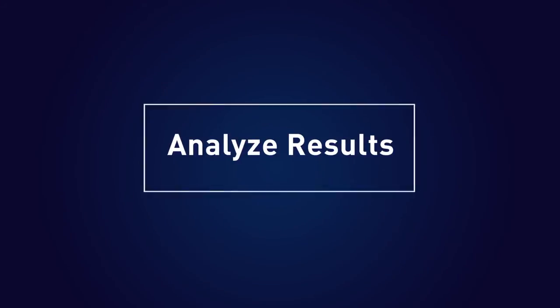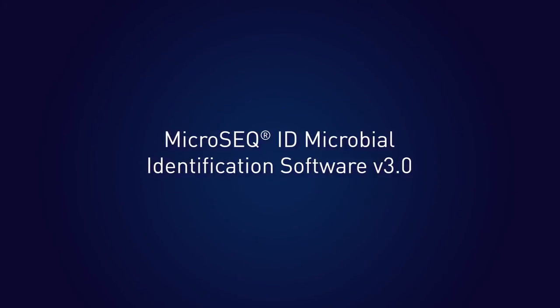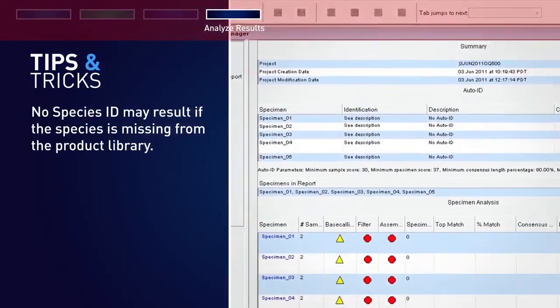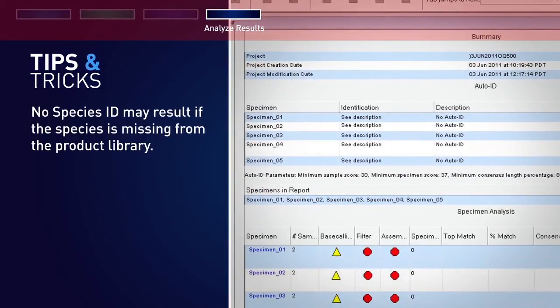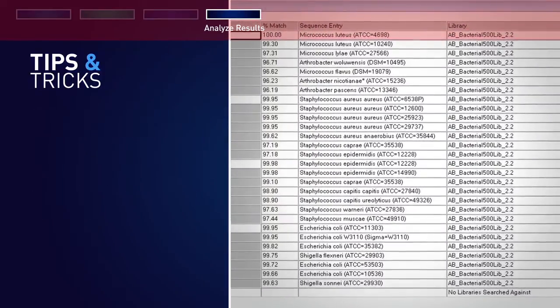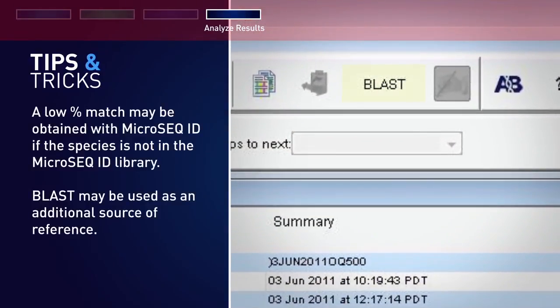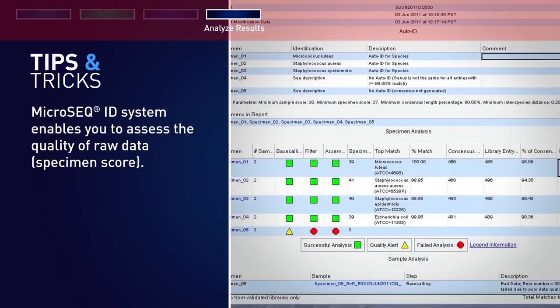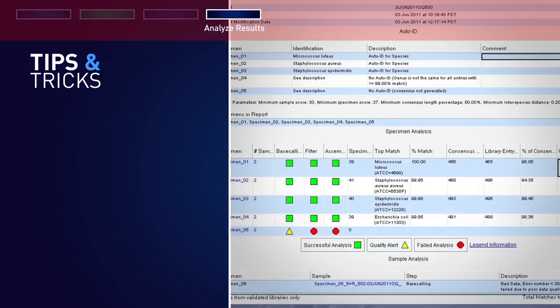The final step of the protocol is to analyze the results. When using MicroSeq identification software, no species ID may result if the species is missing from the product library. MicroSeq ID product libraries are constantly updated, but you can also create and validate your own custom libraries. A low percentage match may be obtained if the species is not in the MicroSeq ID library. BLAST may be used as an additional reference source. The MicroSeq ID system enables you to assess the quality of raw data via a specimen score, which gives additional confidence to the ID result. No other system takes into account the quality of the raw data when assessing ID results.